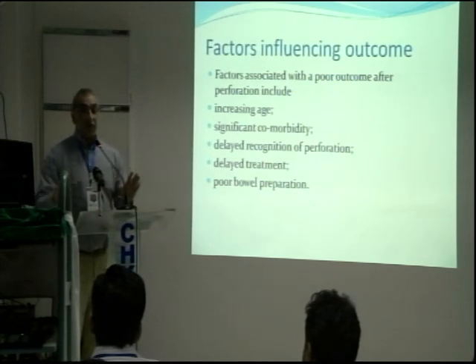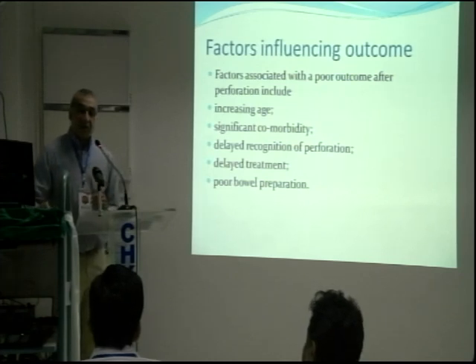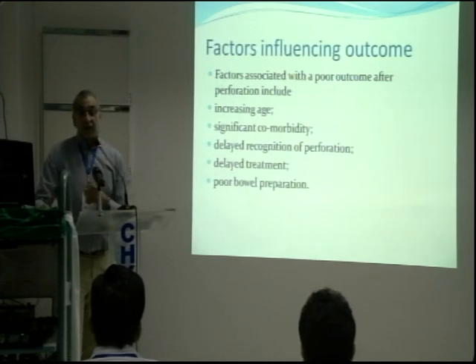Nobody can fault you in a court of law or anywhere because you've done all your procedures properly. However, if you try to tell them, no, it's fine, go, it will be okay, then that is wrong, right? And it's always good if the complication occurs in front of your eyes, then you can pick it up straight away. The risk of further morbidity and mortality is reduced.